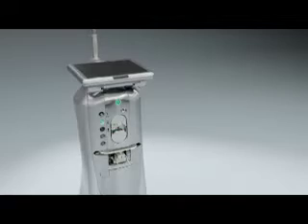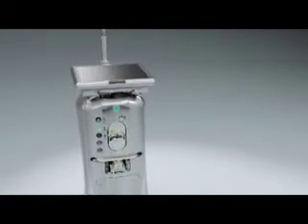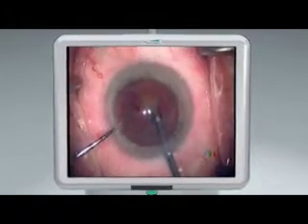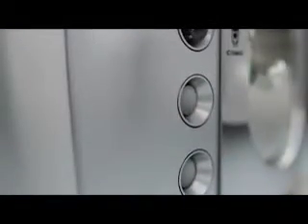The Stellaris system is a revolutionary new phaco emulsification machine designed to support microincision cataract surgery using your current technique, be it coaxial or bimanual, with flow-based or vacuum-based aspiration.